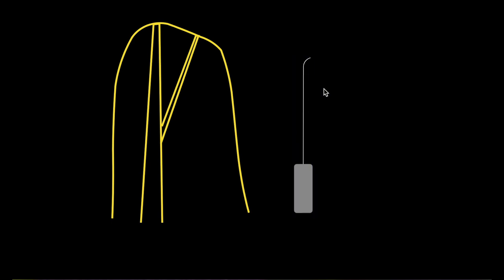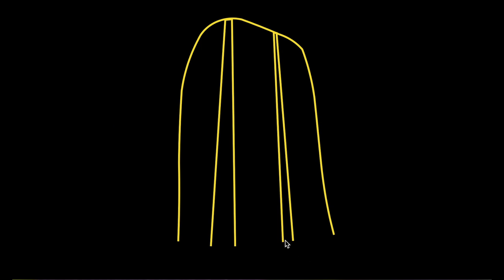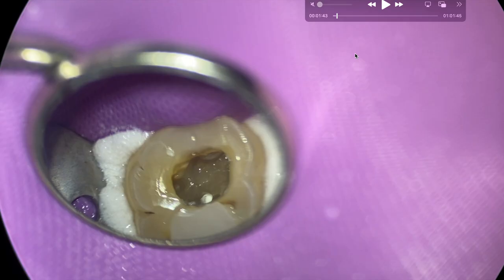So what you're going to see me do is take a hand file, like eight number eights, and actually a secret, I use C plus files. I don't normally do that, but I wanted to make sure I had something with enough stiffness and rigidity to get down there in case there was something ledging or blocking this entrance. I'd made little small bends to get down there and kind of sneak it down there. If I was able to get a bite, then I'd watch wind it down. Cat out of the bag, I didn't need to do this, it didn't work.